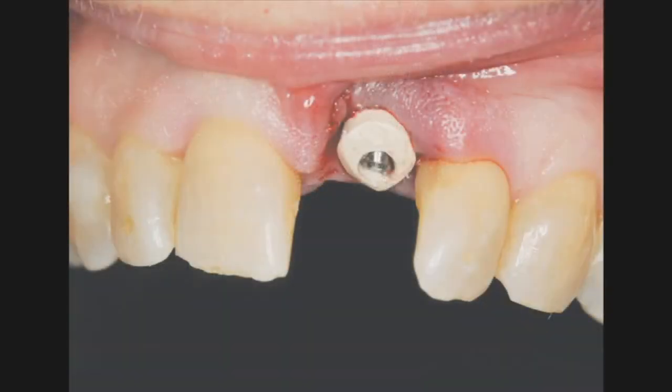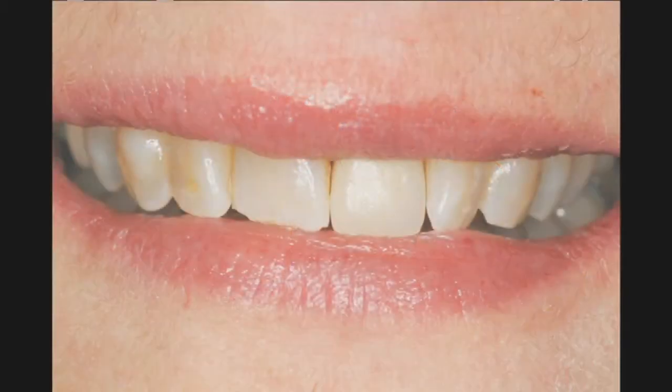Now, even though the implant torqued well for me, I decided, because of the soft tissue, to simply place the custom healing abutment and seat the flipper appliance, allowing integration to progress normally and predictably. We will allow 4 months of healing, and the implant should be in great shape. You can see the flipper is placed, and we got a great aesthetic result. Patient was thrilled, even though they had a removable appliance, because the aesthetics were dramatically improved in our final case.